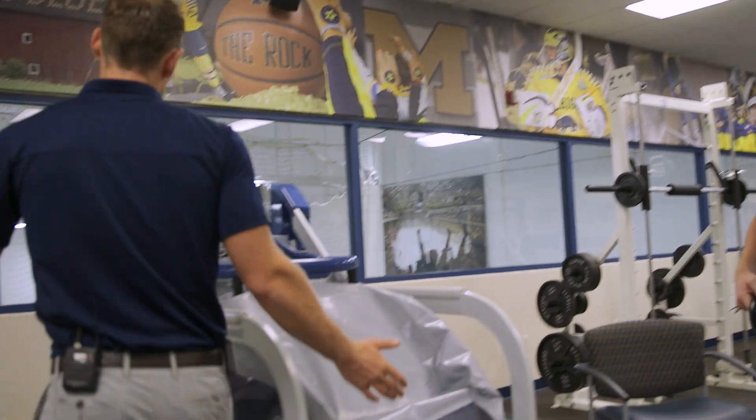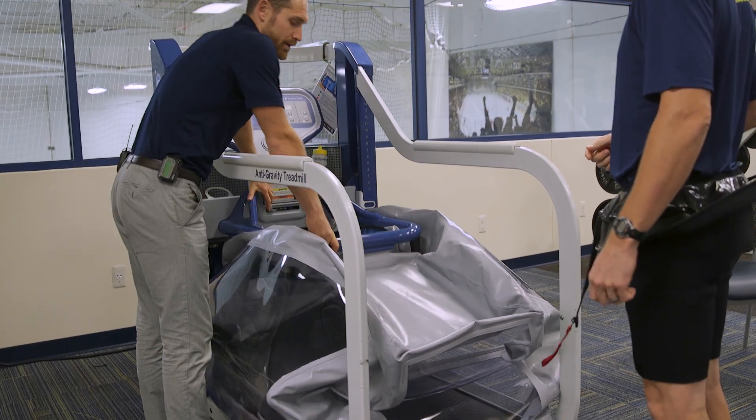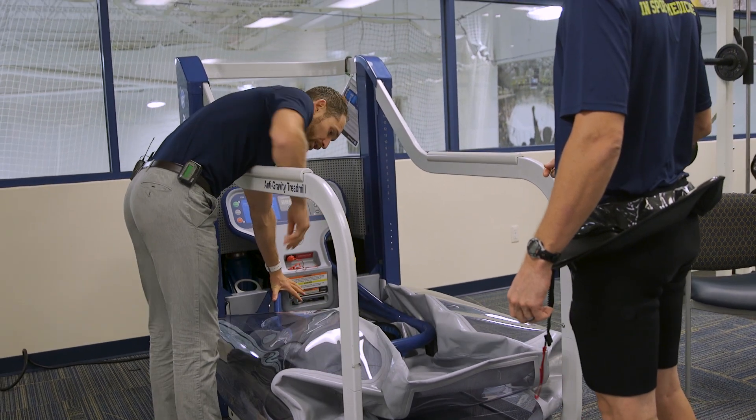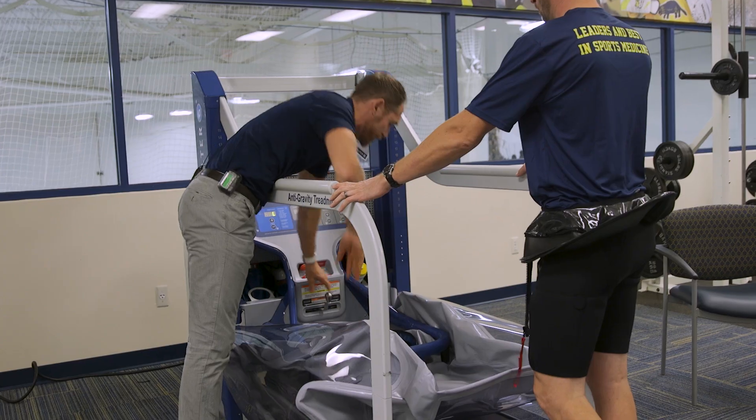We always enter from the back. The cockpit adjusts up and down, so we'll put it all the way down. The nice thing about this is if you do have a patient that might be in a wheelchair or with an altered weight bearing status, they can kind of wheel right up to it.